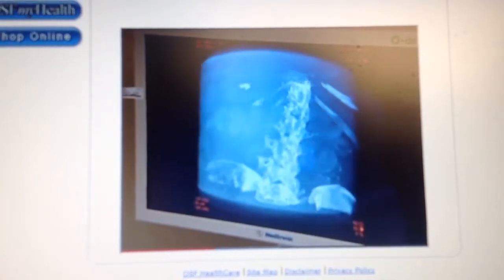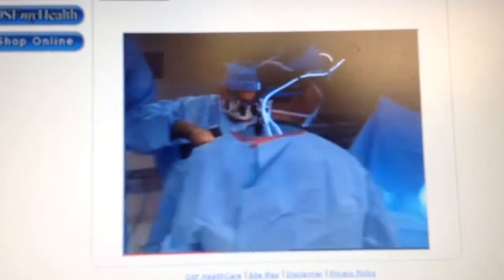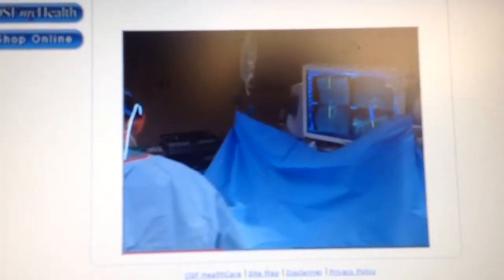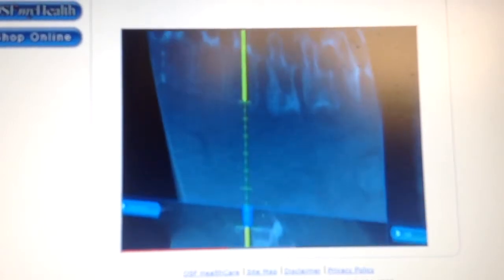improve upon our surgeries. It's exciting to be in the operating room and see a situation where you would struggle maybe for a half hour trying to precisely place a screw, and now using that bit of navigation, within a minute to 2 minutes, you can place a screw exactly in the perfect location.